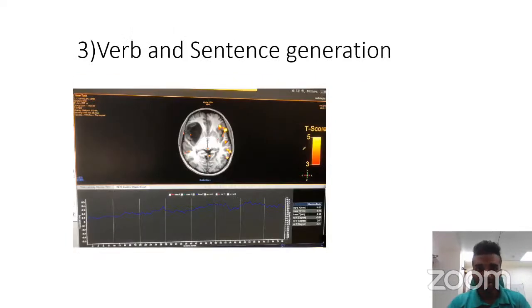And this is another interesting case where you could see the patient has a large lesion in the right Sylvian region, and we know that Wernicke's region is mainly controlling the patient's thinking ability. So we just need to make sure which side of this patient's brain is controlling his thinking ability, whether it's right or left. So we gave this patient random words to think of.